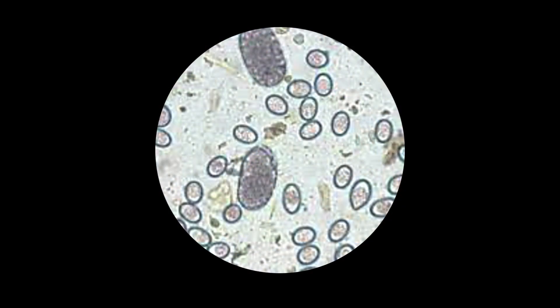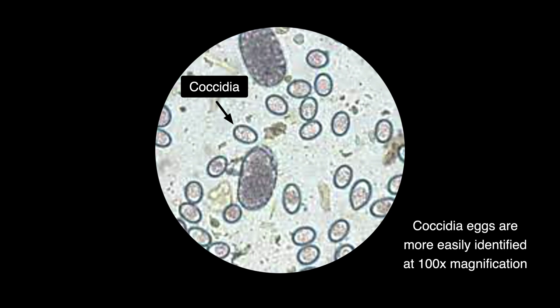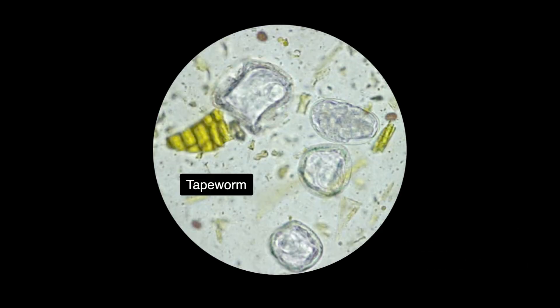Another egg you might want to be on the lookout for is coccidia, which can cause issues in young goats with symptoms of diarrhea. Coccidia eggs are about one-third the size of strongylids and have a more defined outer shell — they kind of look like hard-boiled eggs cut in half. You may also see tapeworm eggs that are square or triangular and contain a small, round embryo. But strongylids are the eggs we're most concerned about, so that's what we'll be counting.